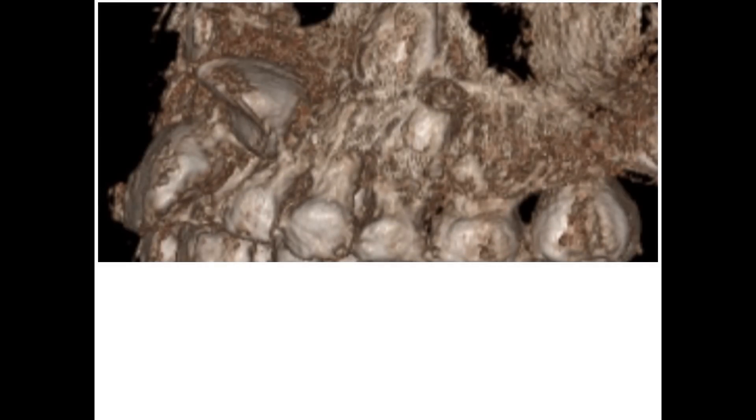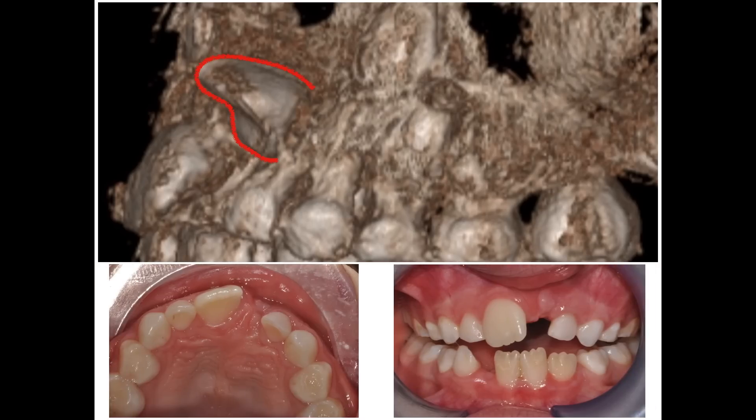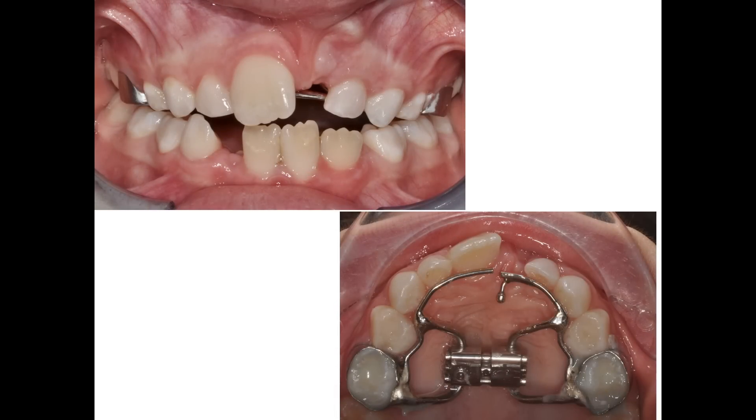The tooth is heavily displaced towards the buccal side but its root seems normal and we have enough space to try to get it into the right position. The first thing I decide to do is to bond the rapid palatal expander which will, after the activations, diminish the bone's resistance to reposition 21 and make some more space.